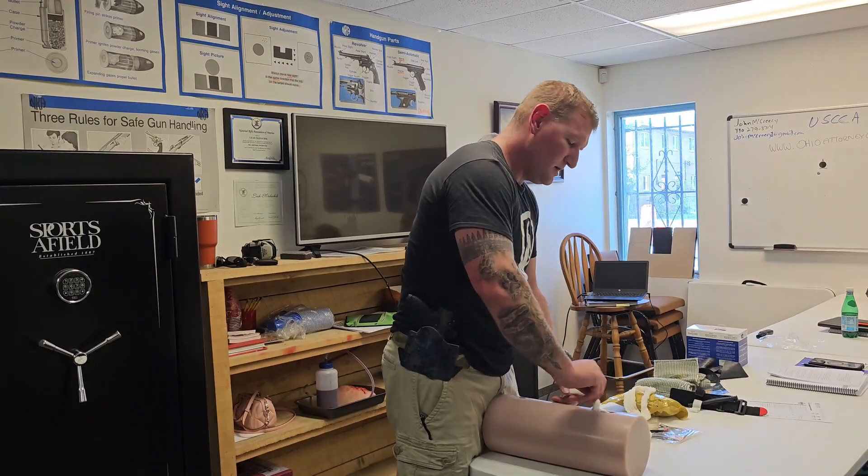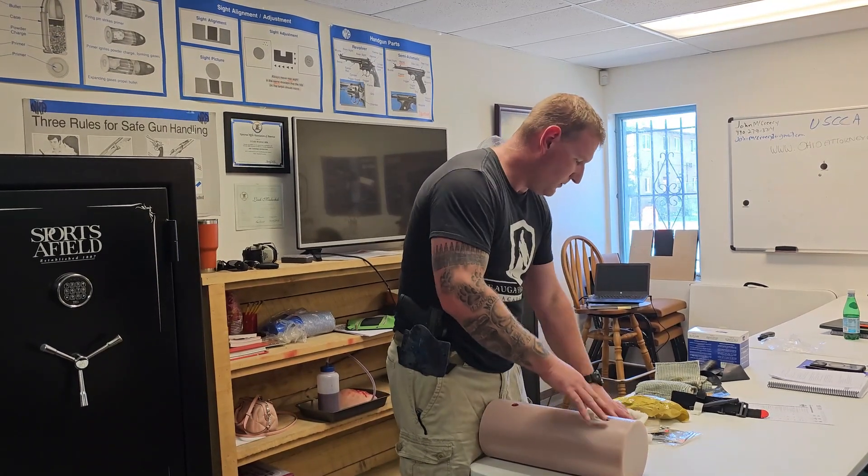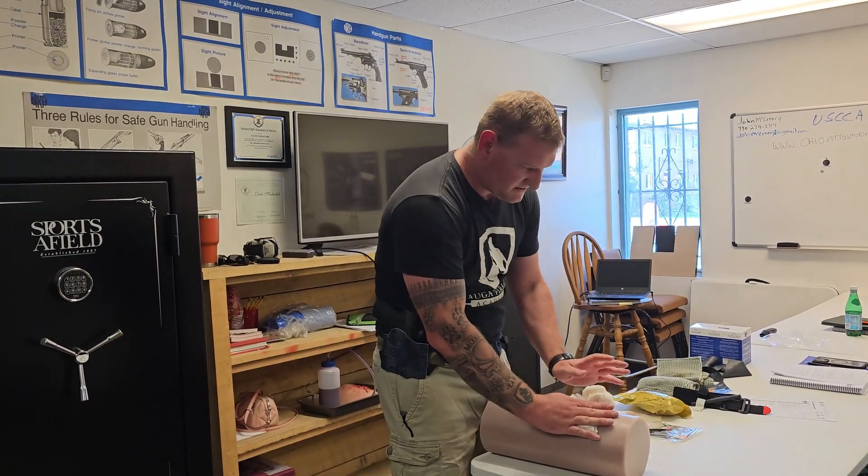I want to get as much of this in as I possibly can. This is super easy right now because we're completely dry, this person isn't moving, this is already opened — this is like the perfect world, and this is never going to happen like this. We're gonna pack, pack, pack — I'll speed this up a little bit until we get to the end.